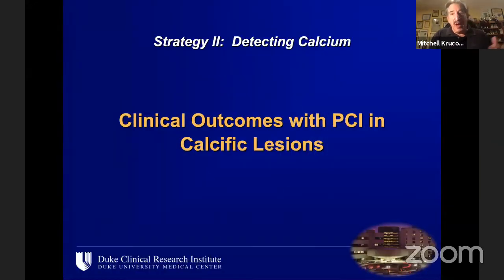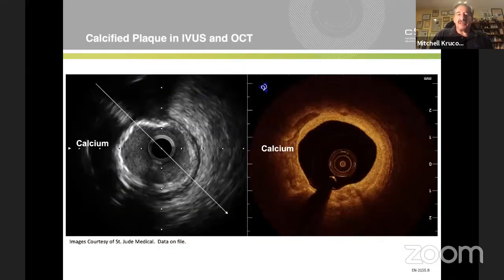Okay, so understanding the why, should we worry about calcium, gets pretty close to home for any operator in a cath lab. How about detecting calcium? And here I think you have a lot of extremely elegant insight from operators, and a lot of the work that's been done in getting imaging capabilities out to centers for more routine use than we have previously seen. And here I think understanding that it matters to the outcomes as well as to planning the procedure, there is no question that it's fine if you see calcium by angiogram to be worried.